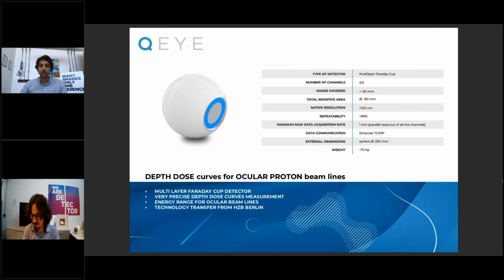So you can maybe think about creating different setups and different settings for your analysis, choose the one you want, and schedule the date and time when you want to perform this analysis. Of course, if you want to go from the acquisition to the analysis in one shot, you have to make sure that when you schedule the analysis, your detector is connected. So maybe you need an operator, or you need some level of automatization also outside the analysis platform, the HiQ.